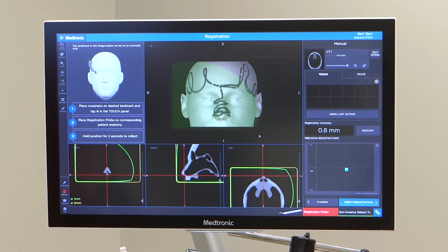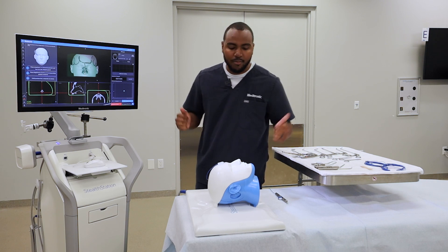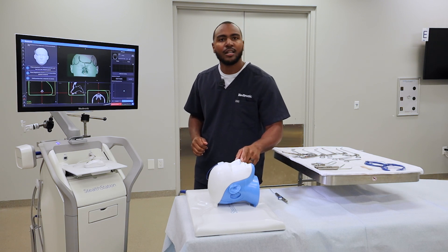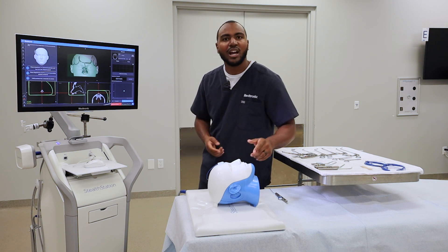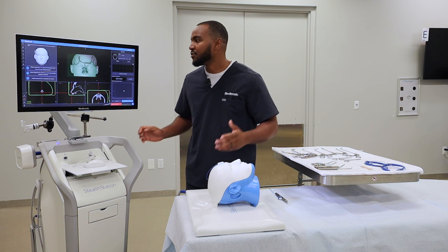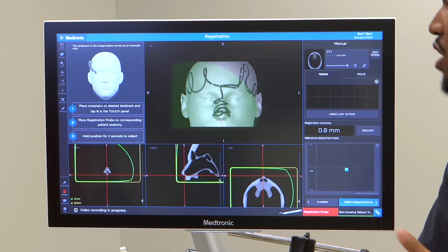Various points to collect: great points of anatomy are the columella, bridge of the nose, inner and outer canthus, as well as right and left tragus. For this video, I'm going to use the columella.